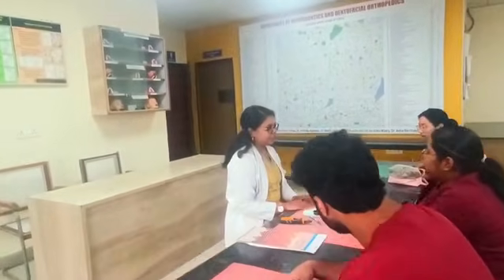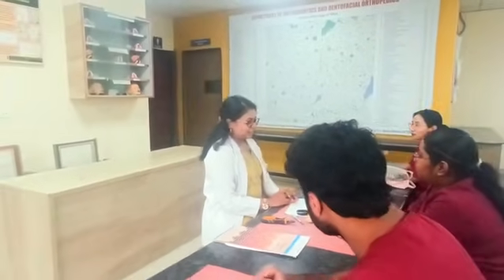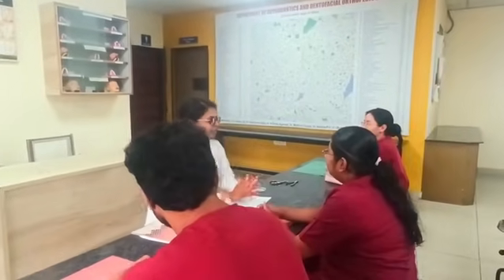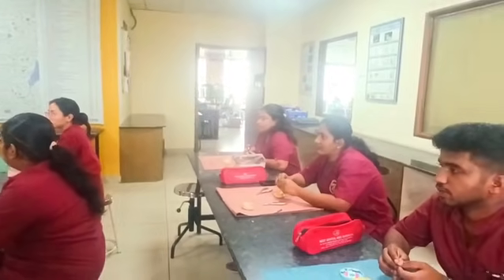I think all of you are prepared for the discussion of Adams clasp. Are you guys prepared? Okay. Who gave the Adams clasp? Can you tell me anyone of you? It was given by Cyril Philip Adams. Okay. What are the parts of the Adams clasp?